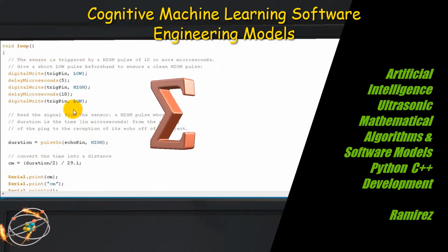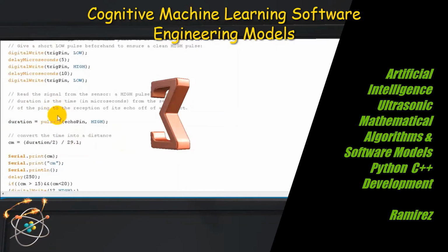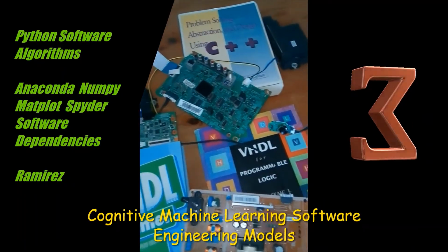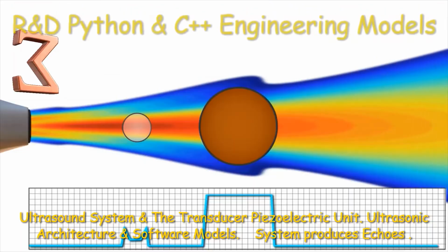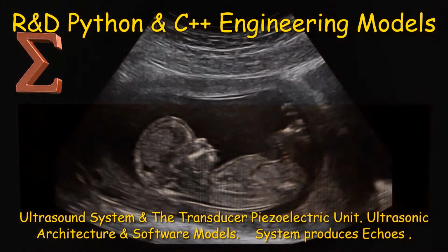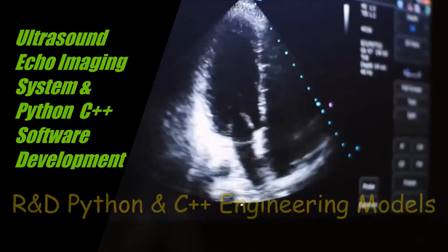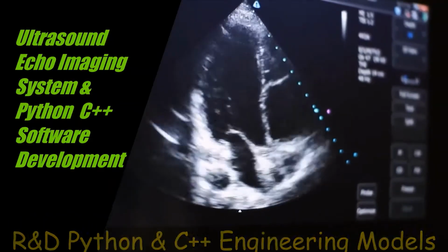As filtering and bandpass consume most of the processing power, which is about 80% of the processing power of the digital converter, the module allows signal envelope detection. This enables the first compression of the data to be transmitted to the user.